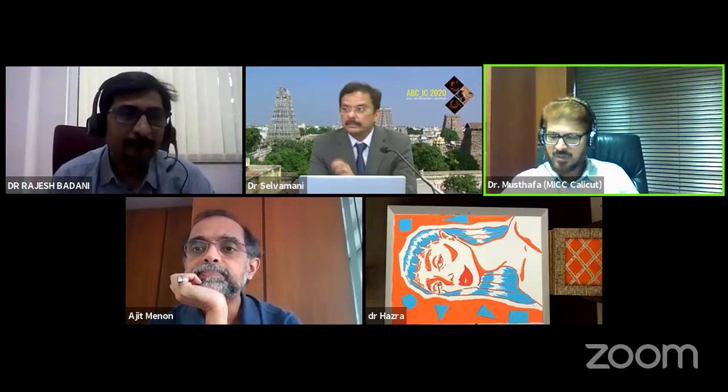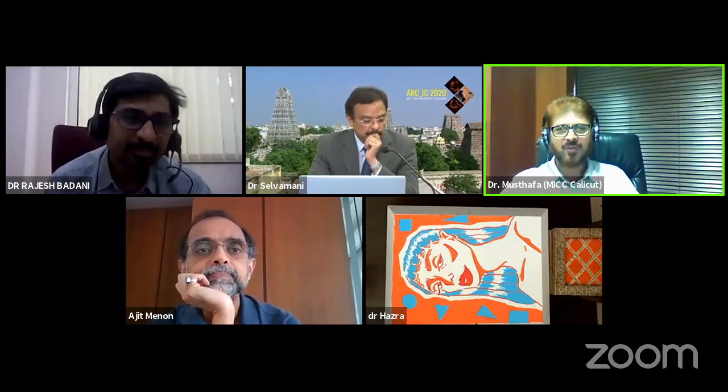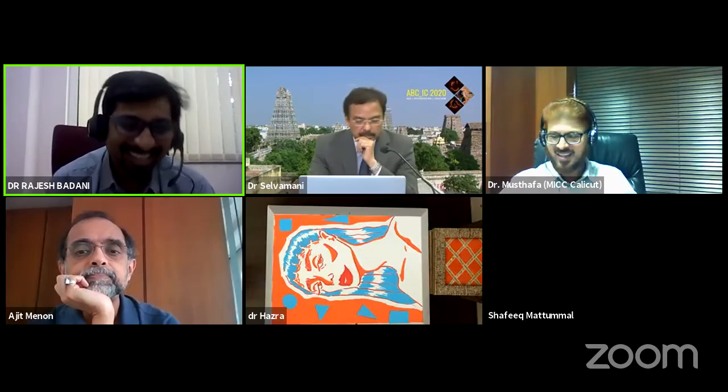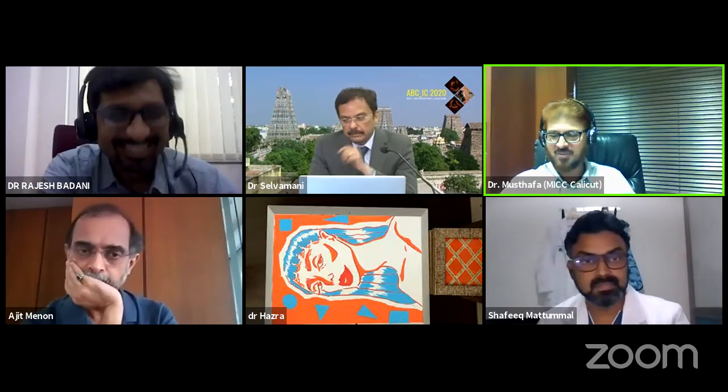Dr. Rajesh, it was a very well done case, and the end result is excellent. Just one small comment: having gone through the femoral route and planned for a bifurcation, I would have selected a 7 French guide, so that it will make our life a little more comfortable. That's the only difference. And if it would have been through radial, definitely 6 is the one we use.